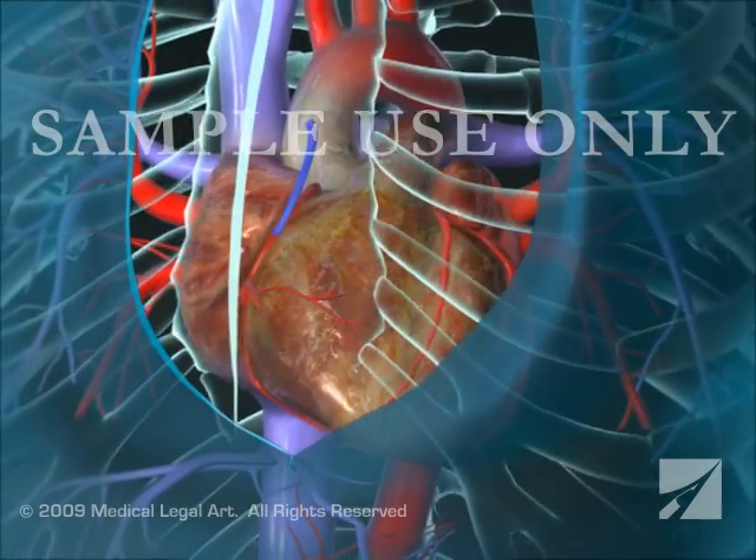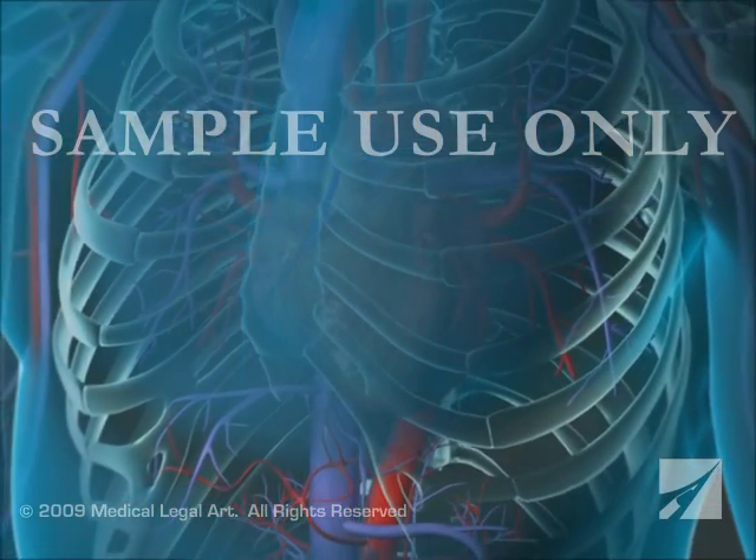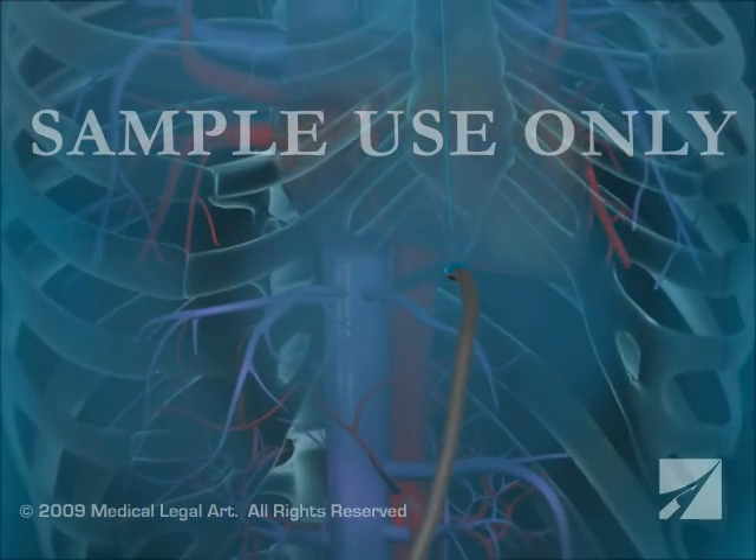Your surgeon will wire the breastbone back together and suture the skin incision closed. A temporary drainage tube will be placed through the skin beneath the incision.